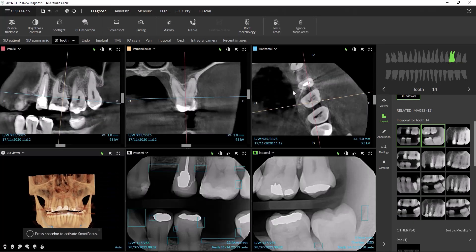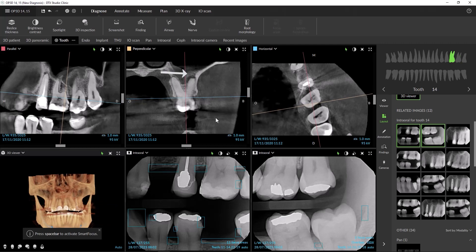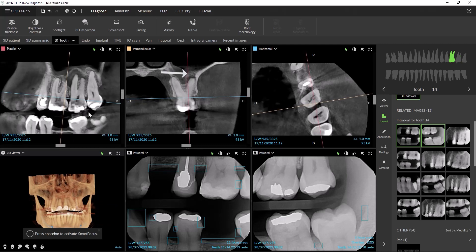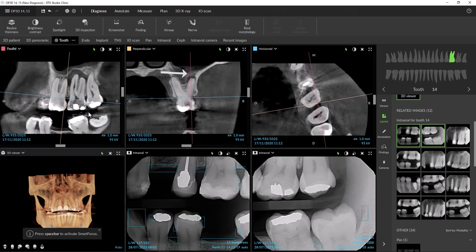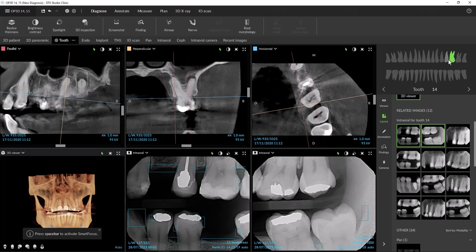We can use our tooth-by-tooth navigation to inspect tooth 14. As I scroll through the NPR views, we can see this lesion is present in the sagittal and coronal views as well.